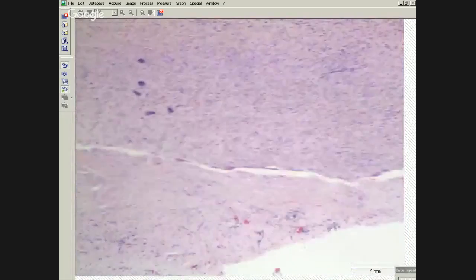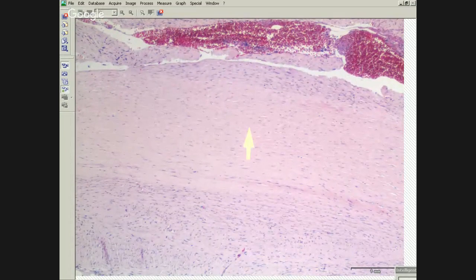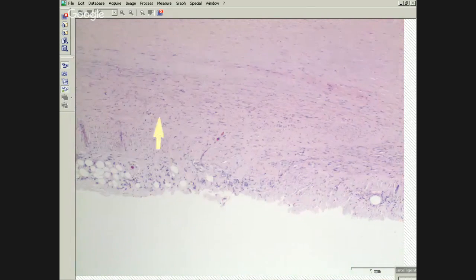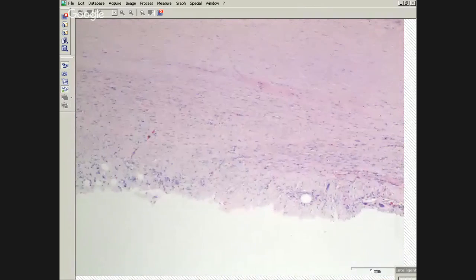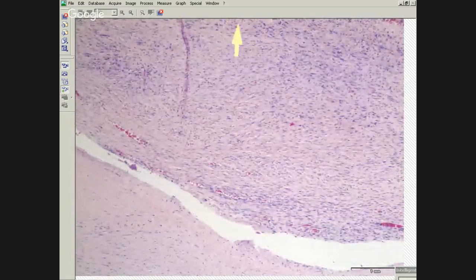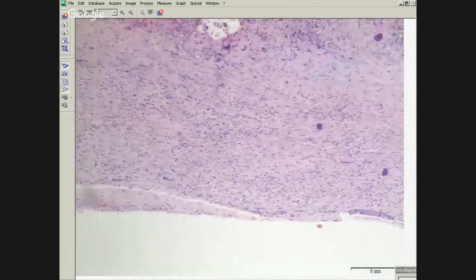We do have an area here that's still more plaque-like, very linear, not very cellular. But even here you can see it's starting to get a bit more cellular. This would be an area that would be bothersome on biopsy, particularly because you've got some cells infiltrating the fat over here as well. But I think if you just had this, it would be tricky. Here it's getting much more cellular, more pleomorphic, and there's a much more haphazard growth pattern.